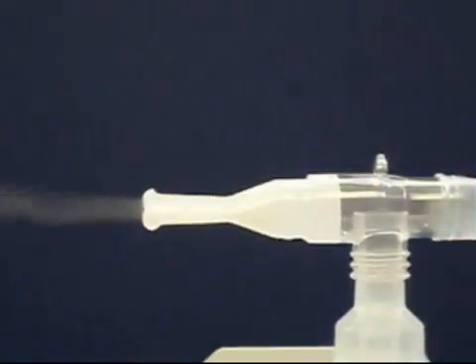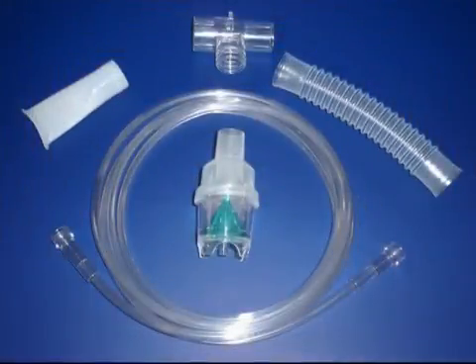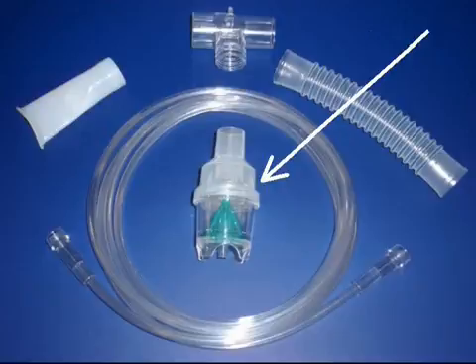The handheld nebulizer uses air from the compressor to turn the liquid medication that your doctor prescribed into a very fine mist that you can breathe. Open the plastic bag containing your number 8900 nebulizer kit and identify the contents. The kit should include a handheld nebulizer that holds the medication during treatment and turns it into a fine mist.